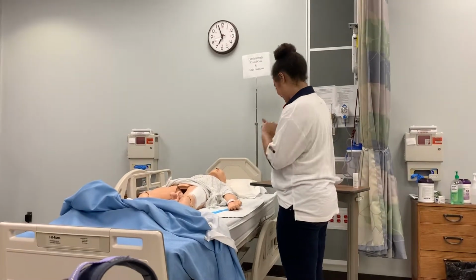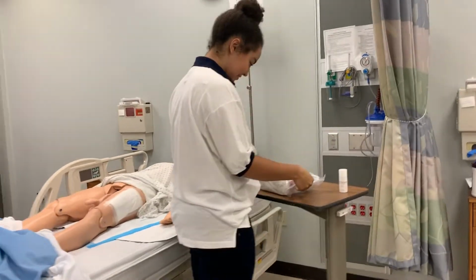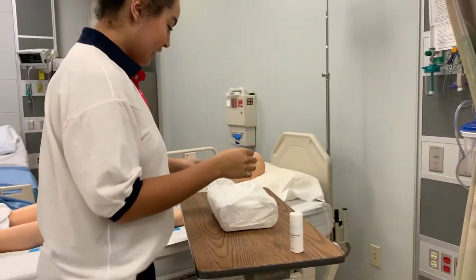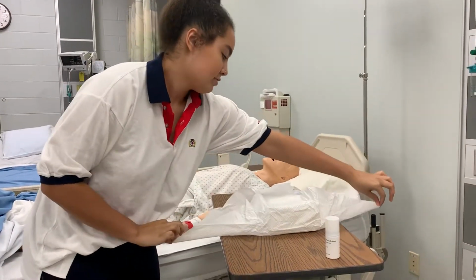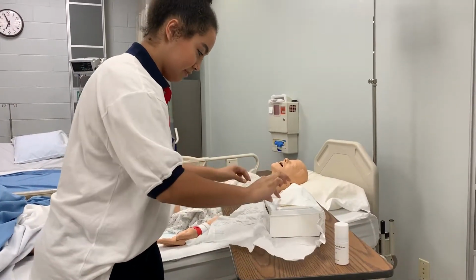Okay, so I'm going to unpack my sterile package. I'm going to discard of that outside, and I'm going to keep an eye and only touch the corners of this. And right on top are my sterile gloves.